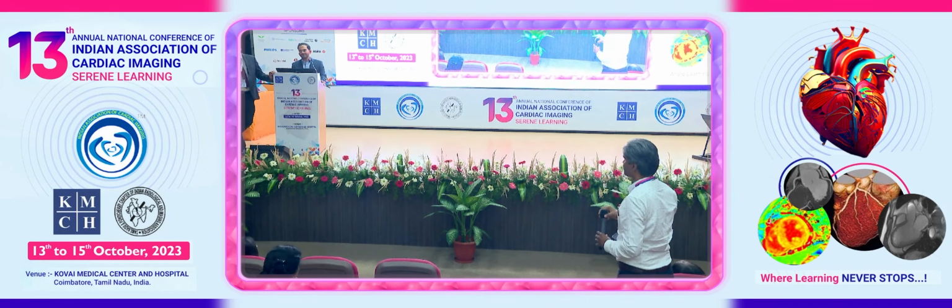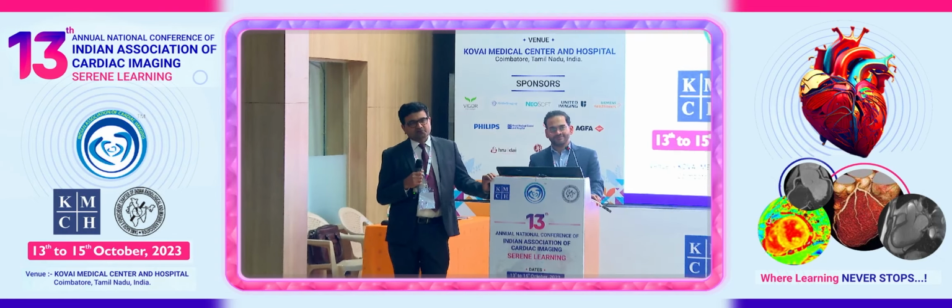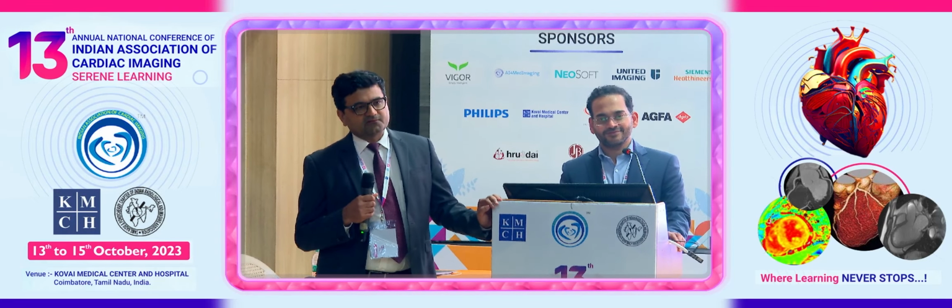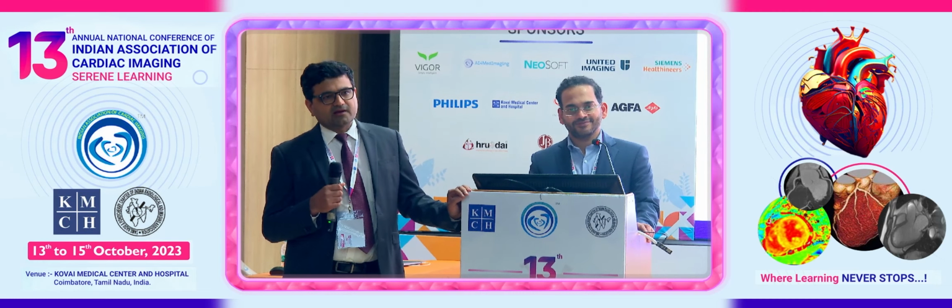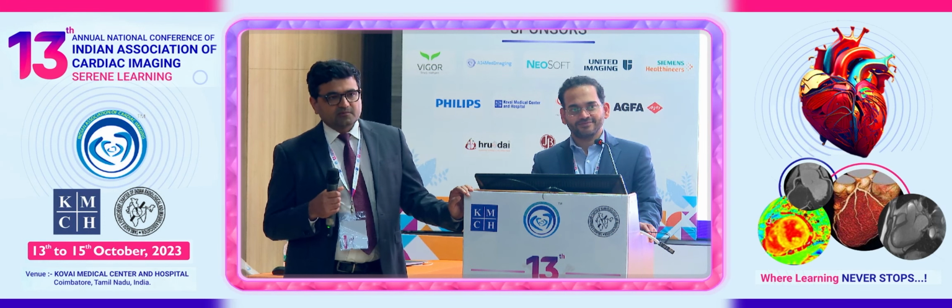Most data is based on Agatston, and people have looked at many different things, but none of them have added any more value. People say very high density plaque is actually protective, because more calcium means more chronic stable plaque. But the most important number remains the total Agatston score.